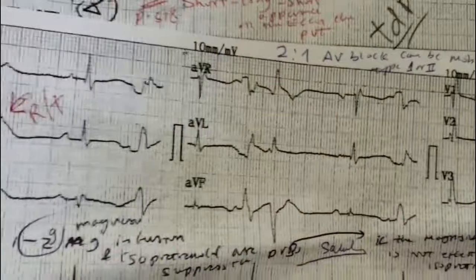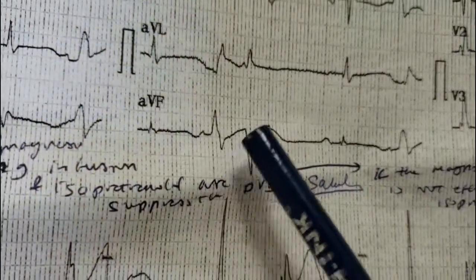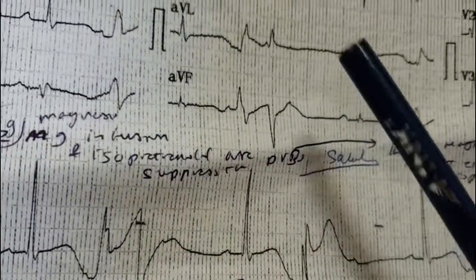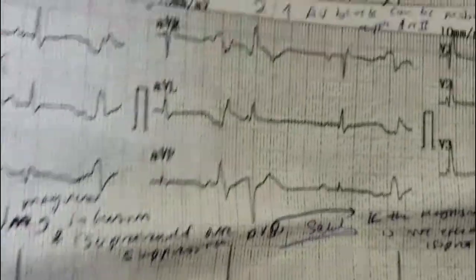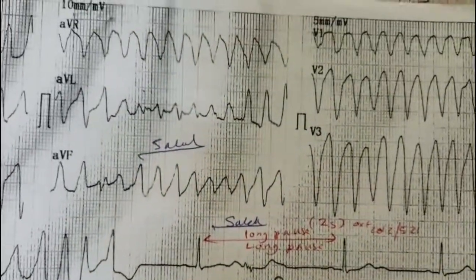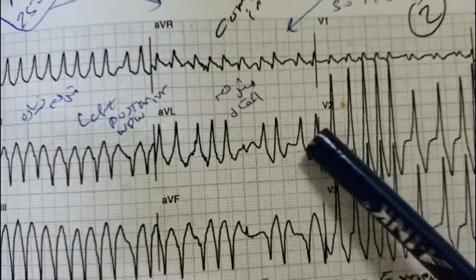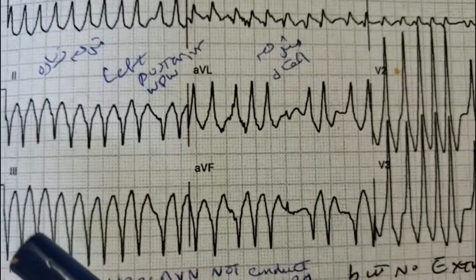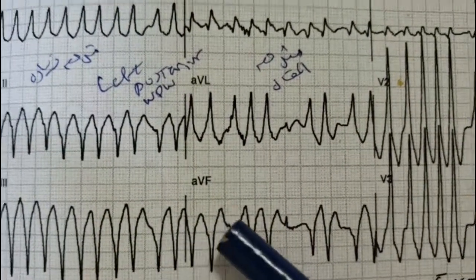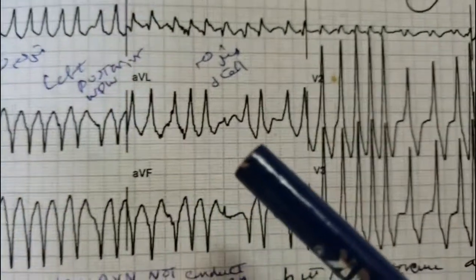And the ECG shows sinus rhythm with a premature ventricular beat coming on the T wave, or R on T. This Torsades de Pointes, one type of polymorphic ventricular tachycardia, is certainly different from atrial fibrillation with WPW syndrome. In WPW syndrome, the direction is uniform because the impulse is coming through an accessory pathway, but it differs in regularity.